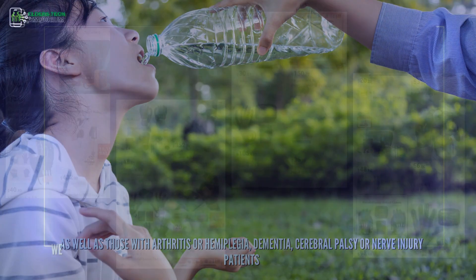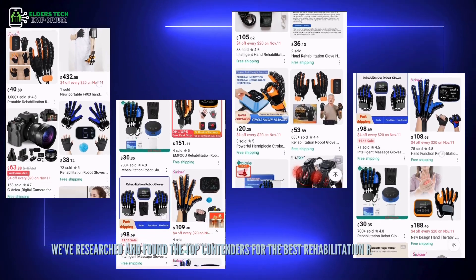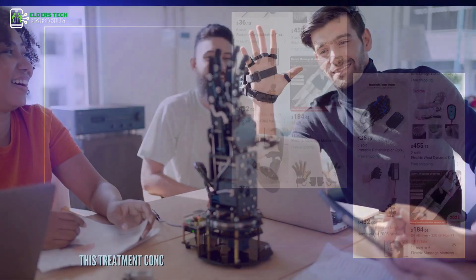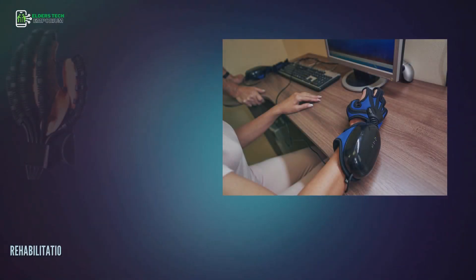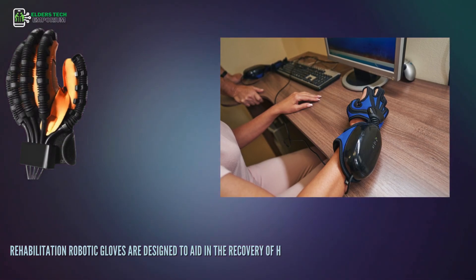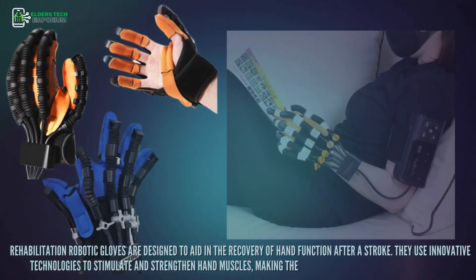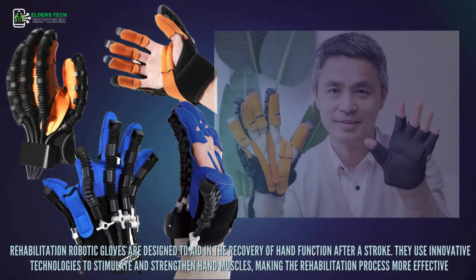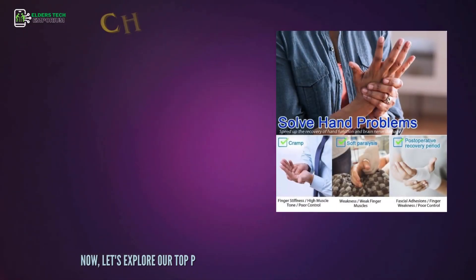We've researched and found the top contenders for the best rehabilitation robotic gloves in 2023 and 2024. This treatment concept originates from advanced robotic arm technology. Rehabilitation robotic gloves are designed to aid in the recovery of hand function after a stroke. They use innovative technologies to stimulate and strengthen hand muscles, making the rehabilitation process more effective. Now, let's explore our top picks.